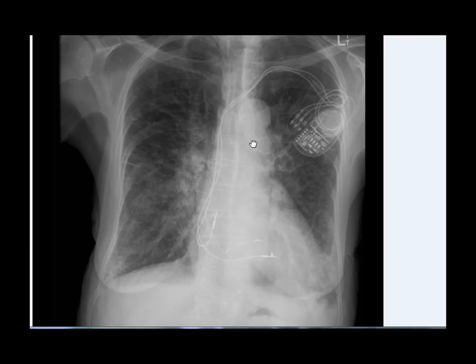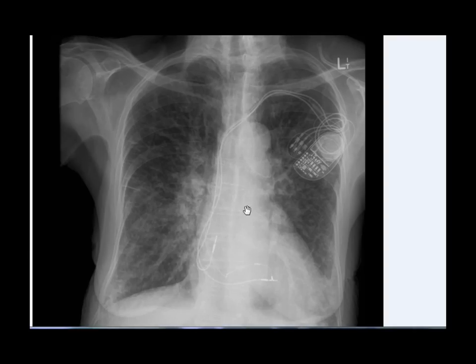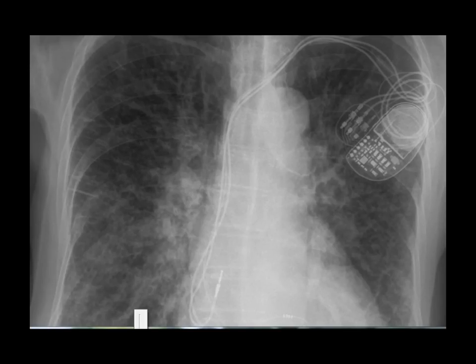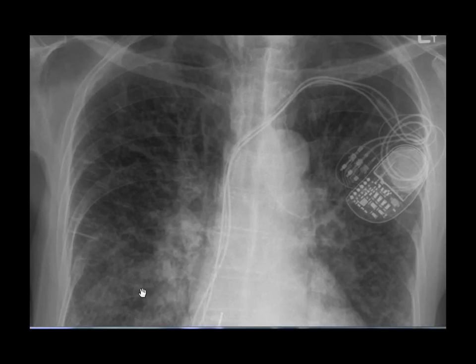Today's video answers a simple question asked by a viewer: how would you differentiate between curly B lines and blood vessels? The answer can be difficult if you don't know a few things, but if you do, it is something very easy.